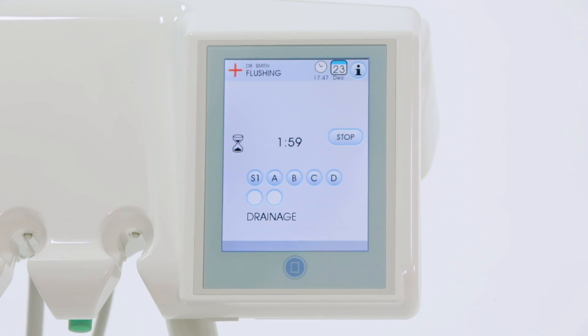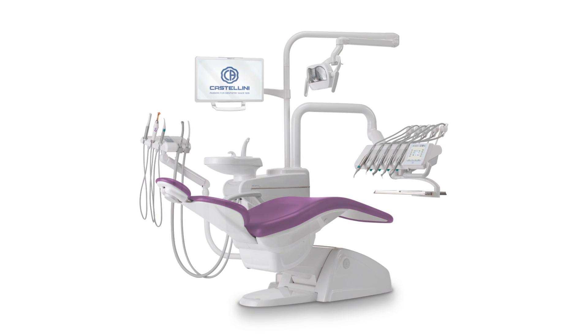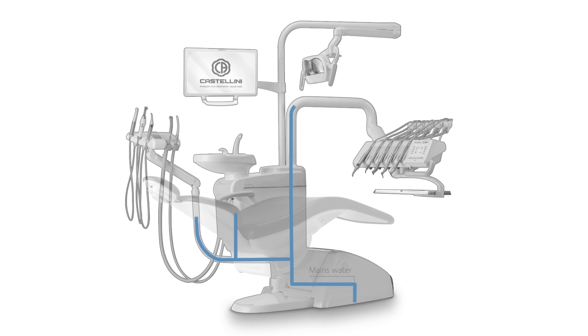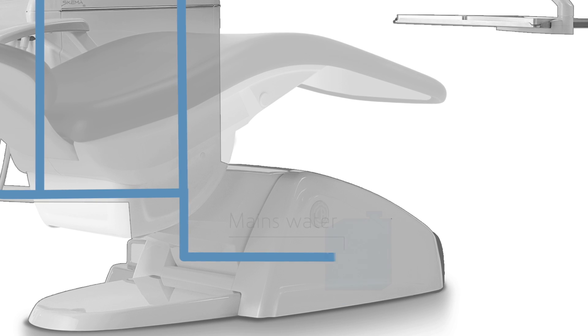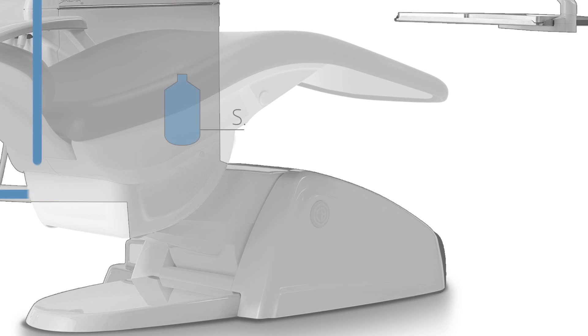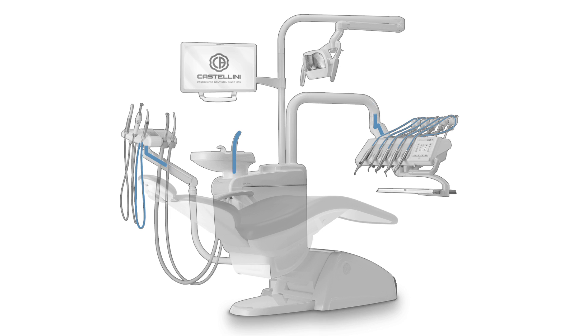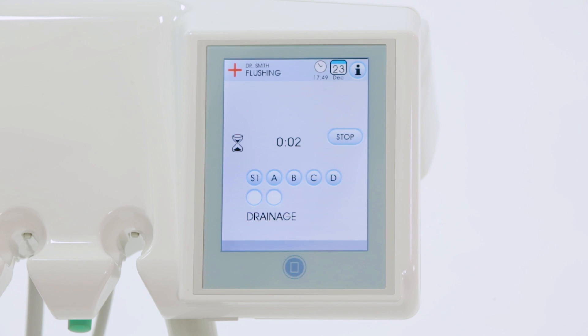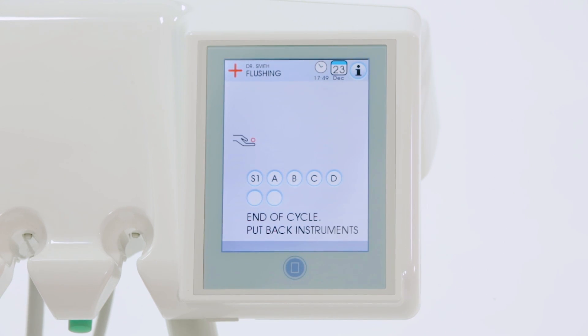Press play to start the cycle. The time flushing system performs a quick and automated cleaning cycle throughout the entire water circuit of the dental unit, by using mains water, MWB, or liquid from the independent supply tank. At the end of the cycle, the suction flow stops and the message prompting to place the instruments back is displayed.